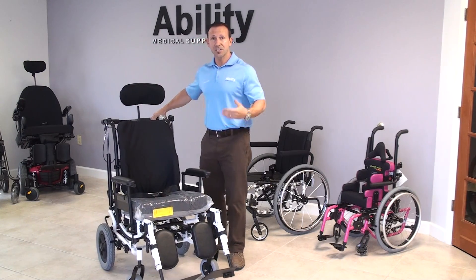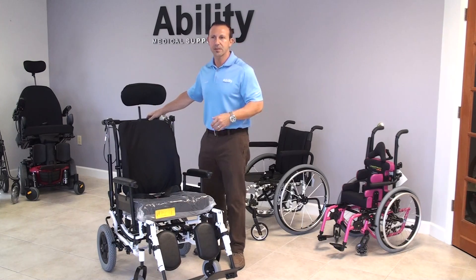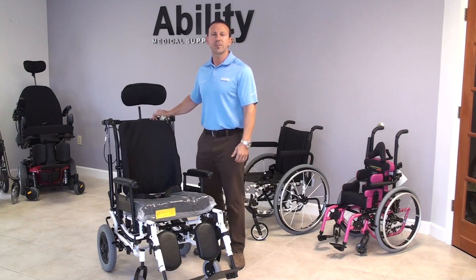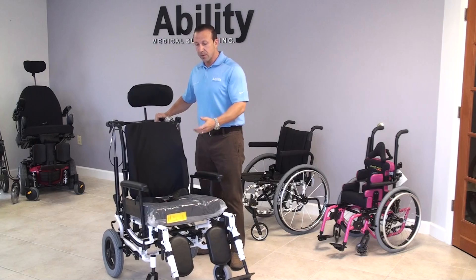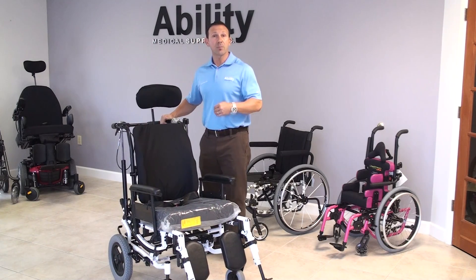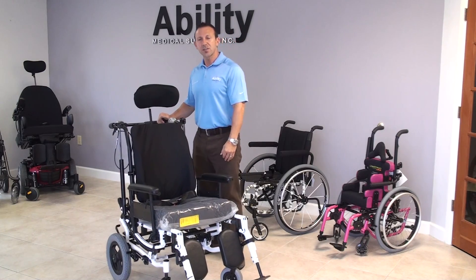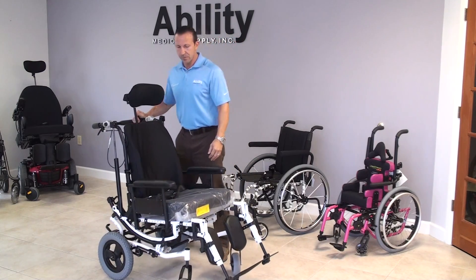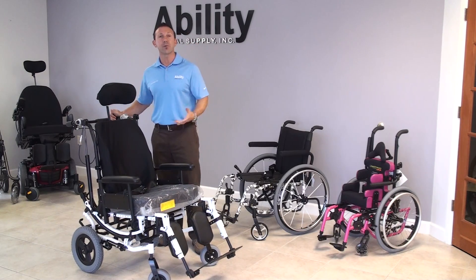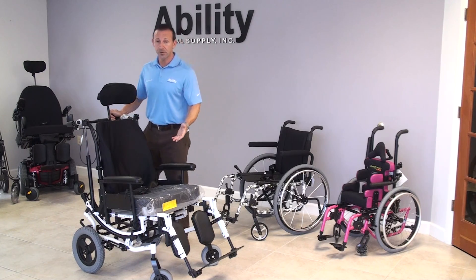People who have high cognition and low function we would try in more of a power operating base, because they would be a safe user of that type of equipment. Someone like this probably has around-the-clock care — maybe a traumatic brain injury, or somebody who just doesn't have the ability to be independent, is definitely non-ambulatory, and not able to shift their own weight. The most important feature on this chair is what we call the tilt feature.